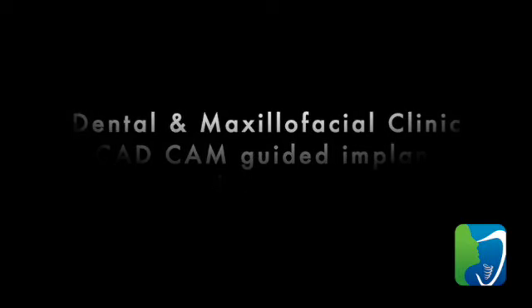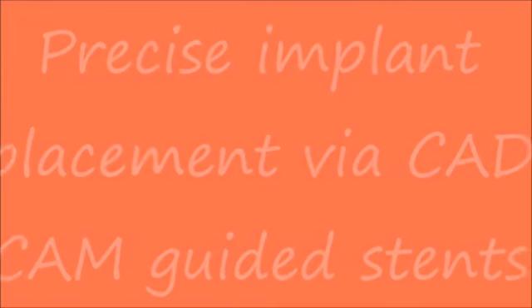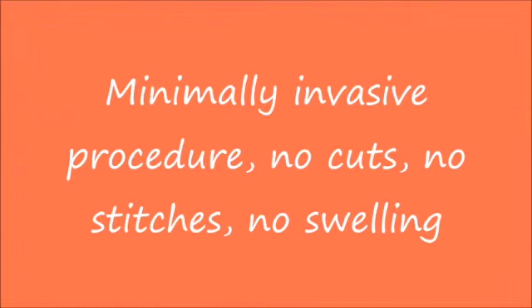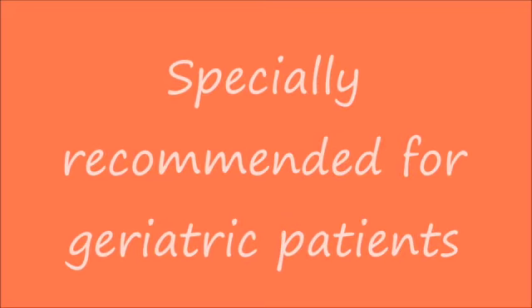We at Dental and Maxillofacial Implant Clinic bring you this video wherein we show you precise implant placement via a CAD CAM guided stent. These stents allow an implant to be placed with minimal discomfort, no cuts, no stitches, no swelling. This procedure is specially recommended for geriatric patients.